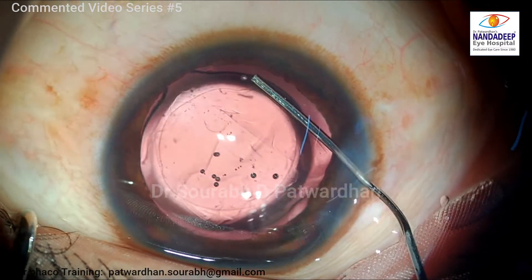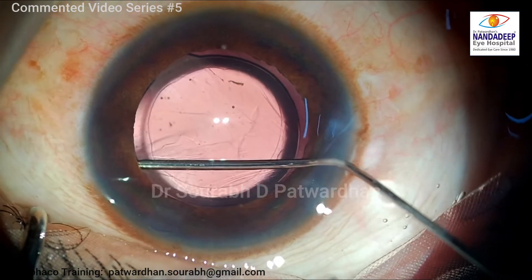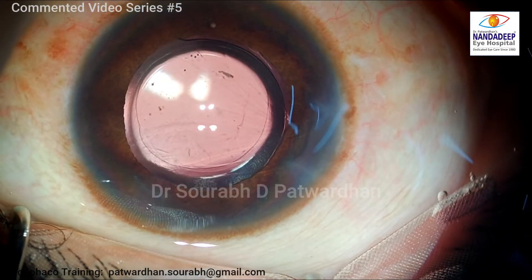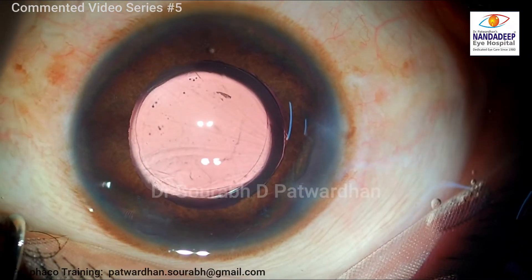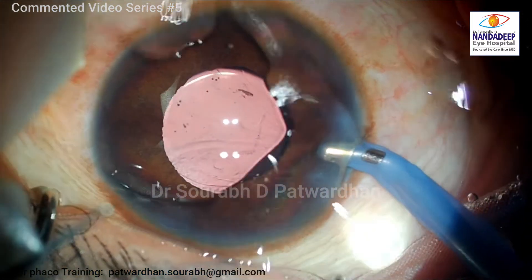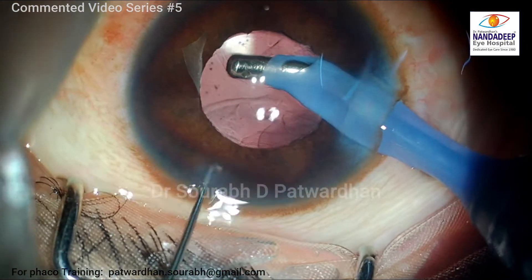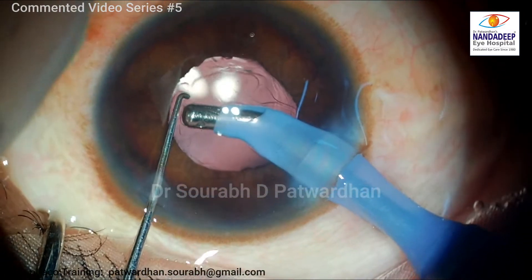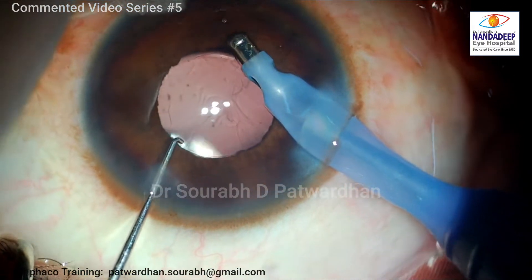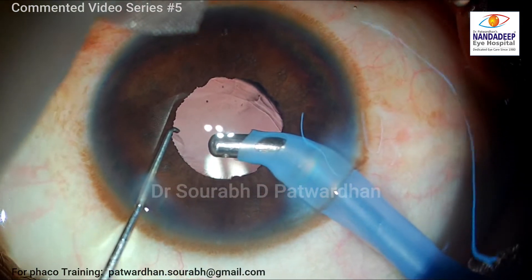If the patient is really young — say 20 to 30 years old — it's not a presbyopic age, so we can put a monofocal IOL for now. Unless the patient has presbyopia in the other eye, there is no point in putting a presbyopia-correcting IOL in this eye, and the patient will not appreciate the visual quality. So it is better to put a monofocal IOL. In post-presbyopic age, of course, there is the choice to use this particular IOL to also correct the patient's presbyopia, with proper explanation.